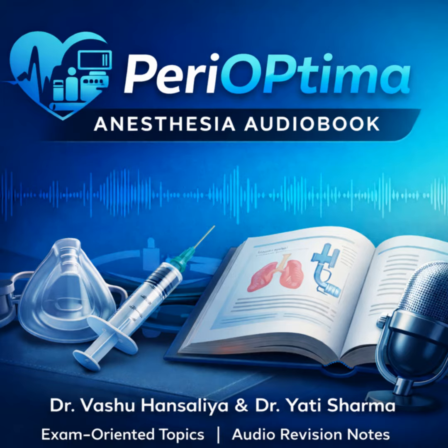Whereas fluid, the sound just cruises right through. Barely any reflection. So the machine hears silence from that area, and silence is painted black. Anechoic. If you can use terms like hyperechoic, anechoic, and acoustic impedance correctly on the first page, you've established technical competence. Okay, now let's talk about the hardware, the transducers. In the exam, I usually just draw a square and a curve and hope for the best.